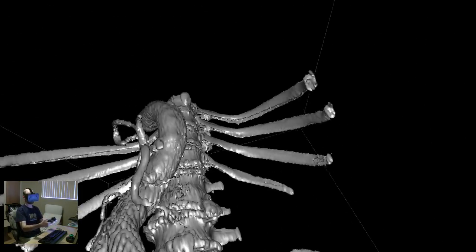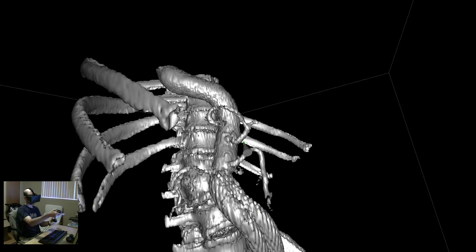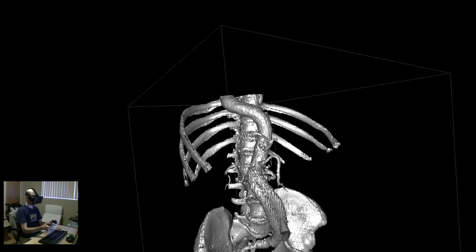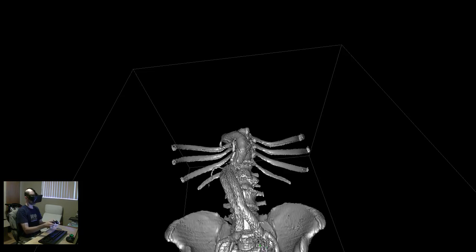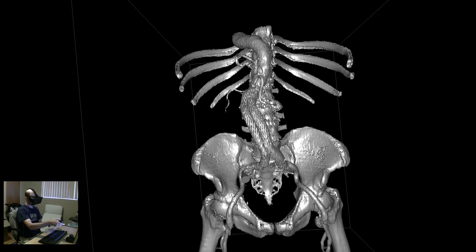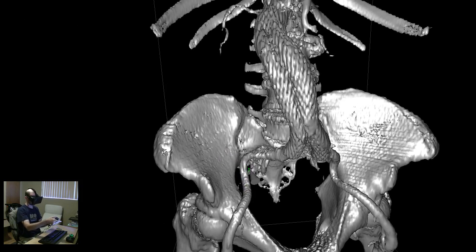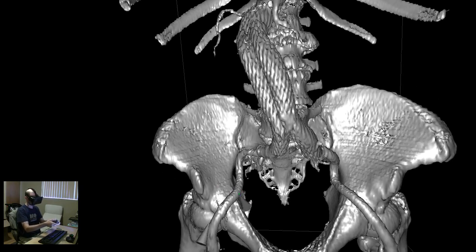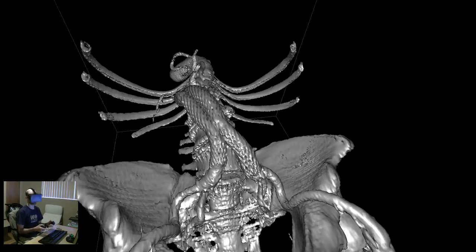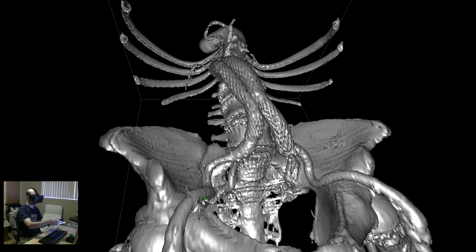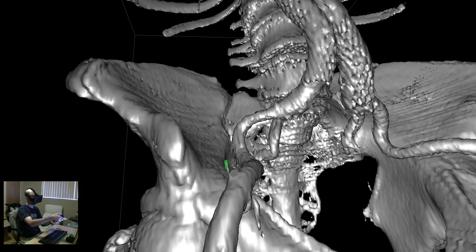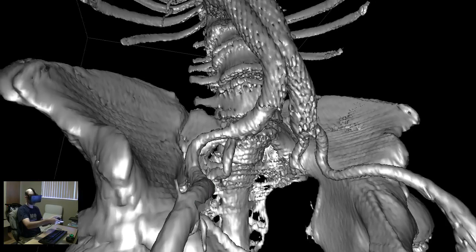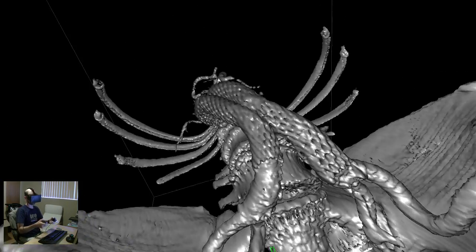You can see the spine here. You can see the ribs coming down the rib cage. You can see a couple of smaller arteries branching off the main one. And so this is a nice way of showing you where that is. Now, the reason why the bones showed up, the reason why the blood vessels have the same density on the CAT scan as the bones, normally they wouldn't, is that the patient before the CAT scan was taken was injected with a contrast agent. And so that's why the blood vessels show up so prominently.